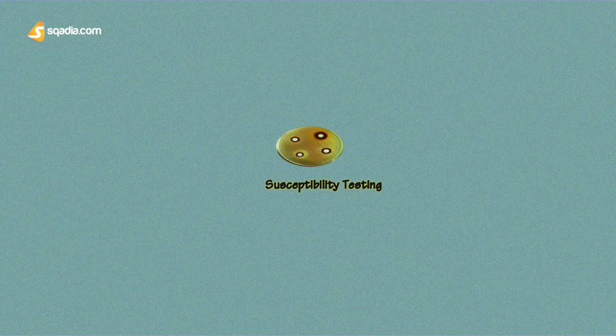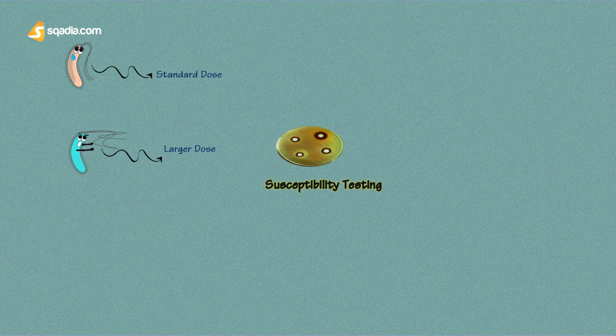A susceptible organism should respond to a standard dose of an antimicrobial. A moderately resistant strain should respond to a larger dose, whereas a resistant organism is likely to fail therapy with the given antibiotic. Clinical response depends on host factors, and in vitro tests only provide an approximate guide to therapy. Several bodies, including the British Society for Antimicrobial Chemotherapy and the Clinical and Laboratory Standards Institute, define the methods and standardize the conditions to ensure the testing is reproducible.